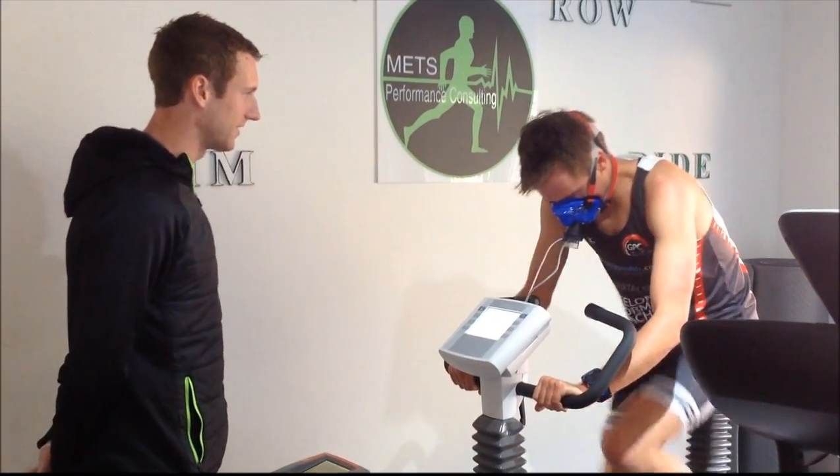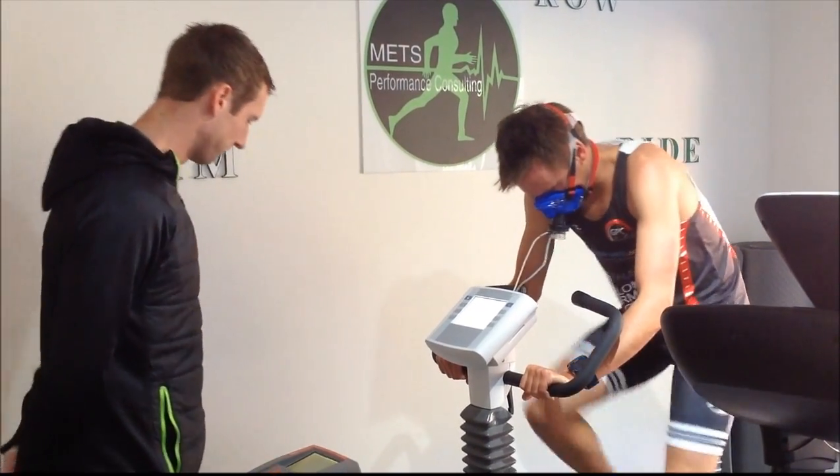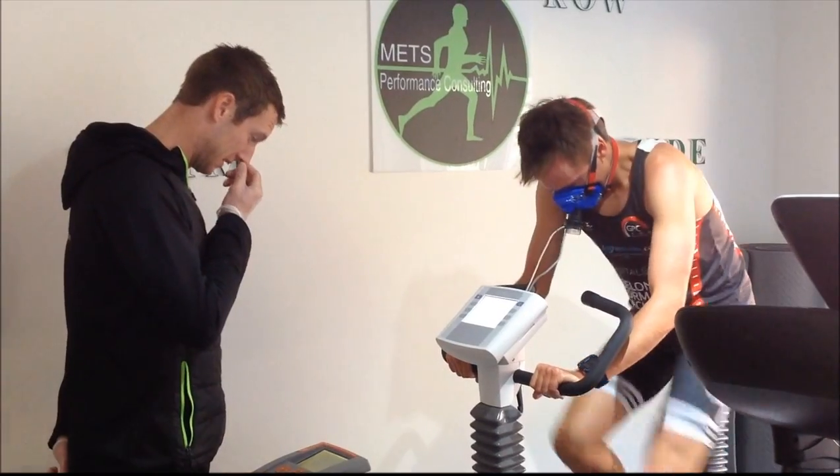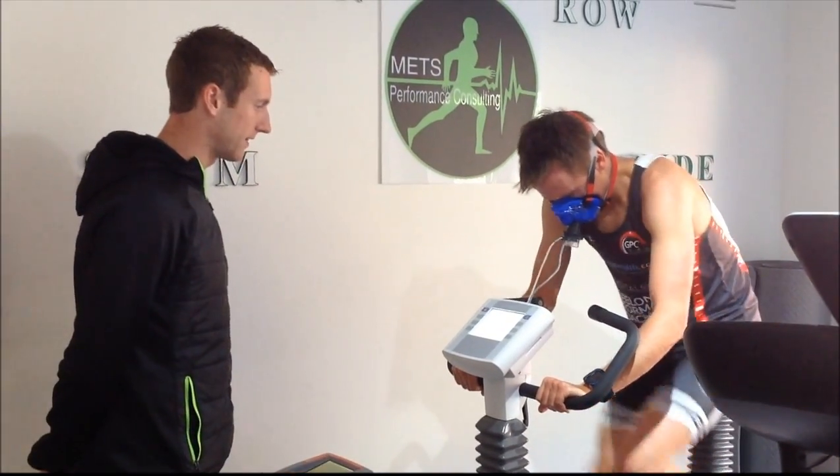10 seconds — need to get at least 15 seconds at this stage, come on. 74.8, come on, you're almost at the 80 here. Alright, up to 360, come on, you're in 30 seconds.